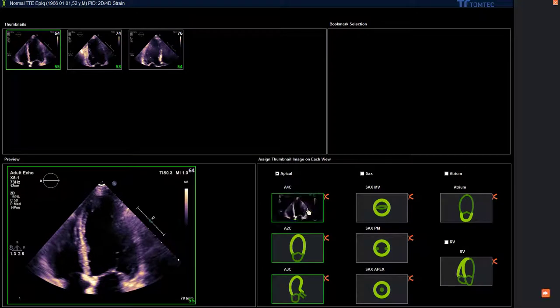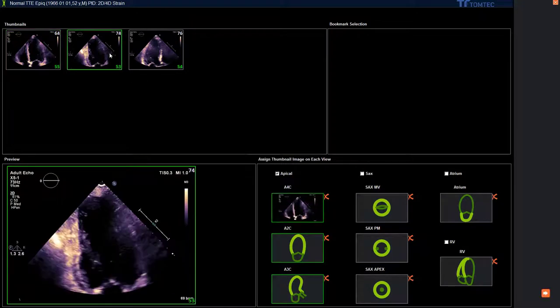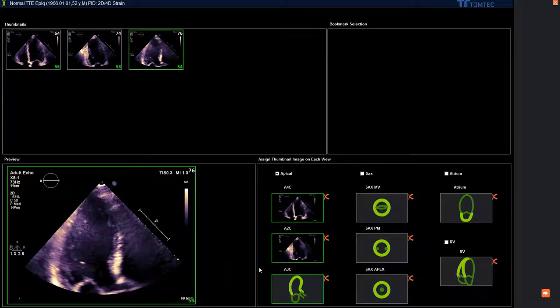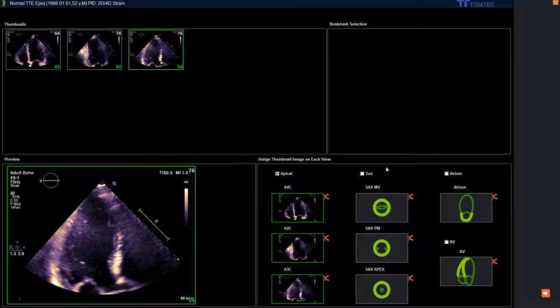Please assign all three views: apical 4, 2, and 3 chamber view. If you do that for the short axis, the orientation is mitral, papillary muscle plane, and apex.